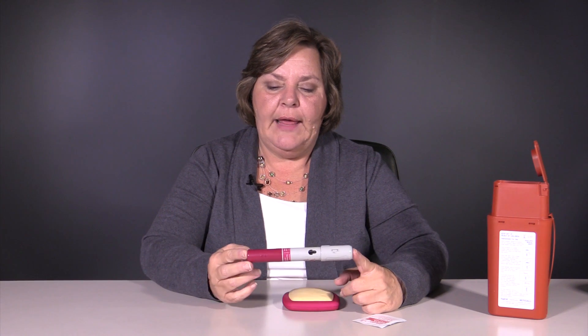Hi, today we're here to learn how to inject Humira. Humira is a TNF inhibitor that comes in an auto injector pen.